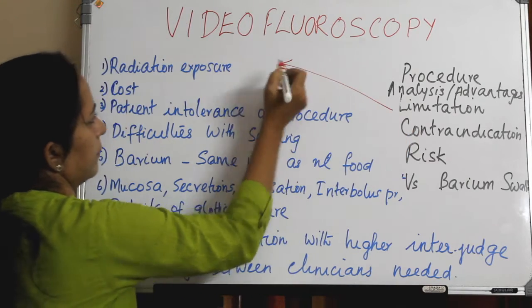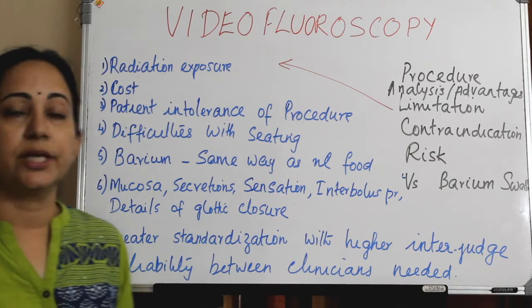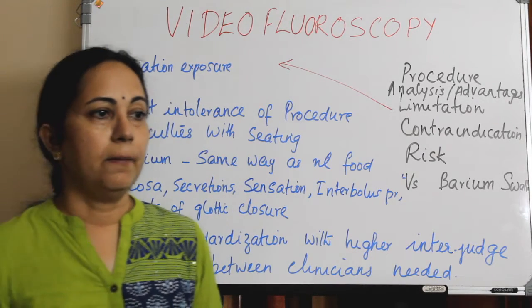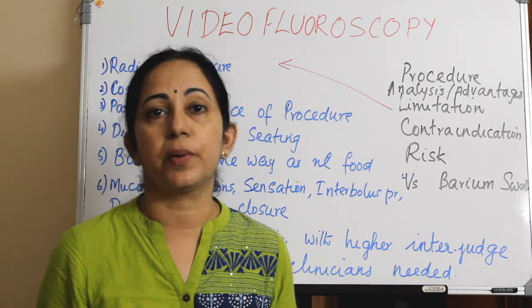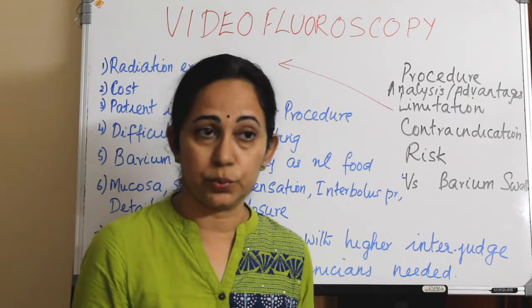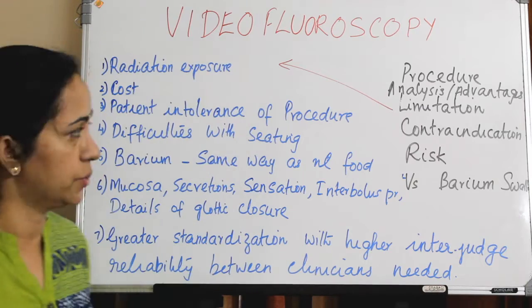Limitations of videofluoroscopy. One is radiation exposure, especially in cases of lengthy and repeated procedures. But for a 3-minute videofluoroscopy, the radiation exposure is equivalent to 2 cervical spine radiographs, and the scattered exposure to the surroundings is also within accepted values.